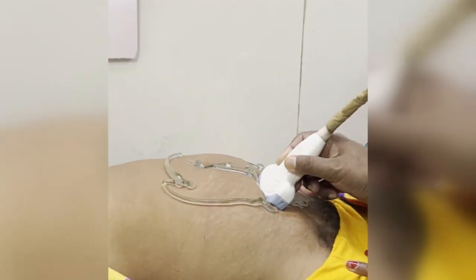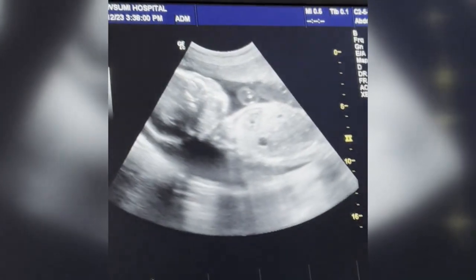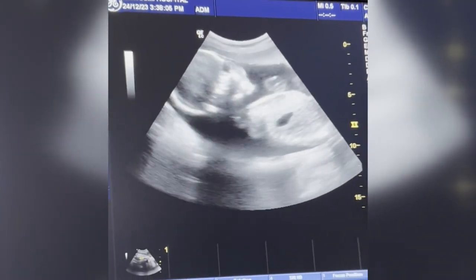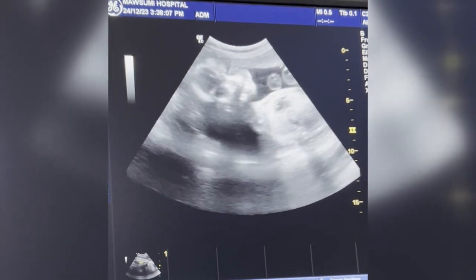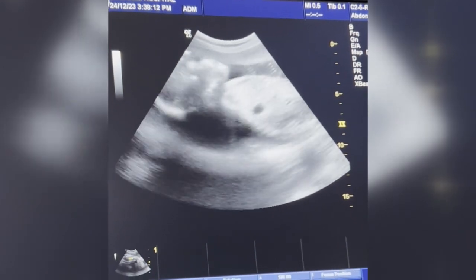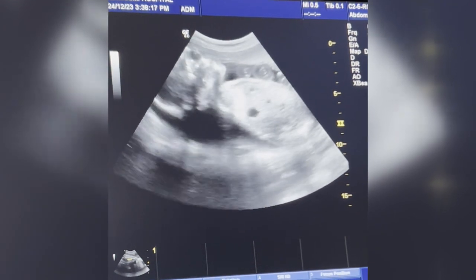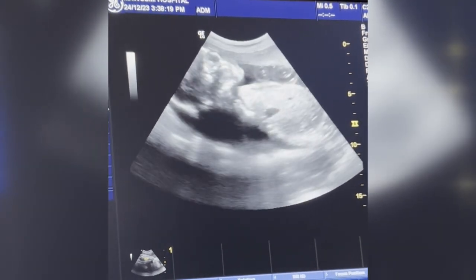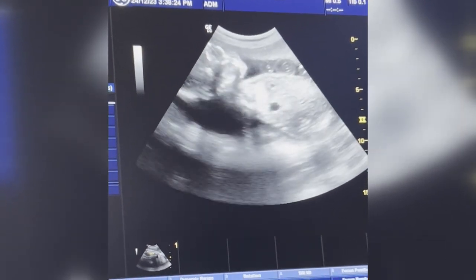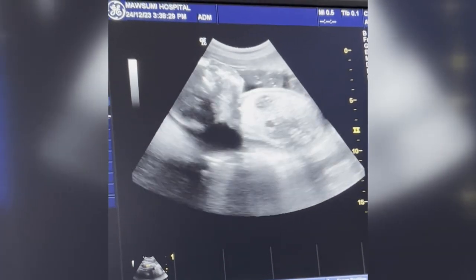Here I am putting my probe. Beautiful. Now the baby is, it is a small baby, very, very cute. See, baby face is displayed. Face is displayed very nicely. Looking to us. Nice, cute baby. Eyes are big, big, big eyes. Okay. It is a living baby.